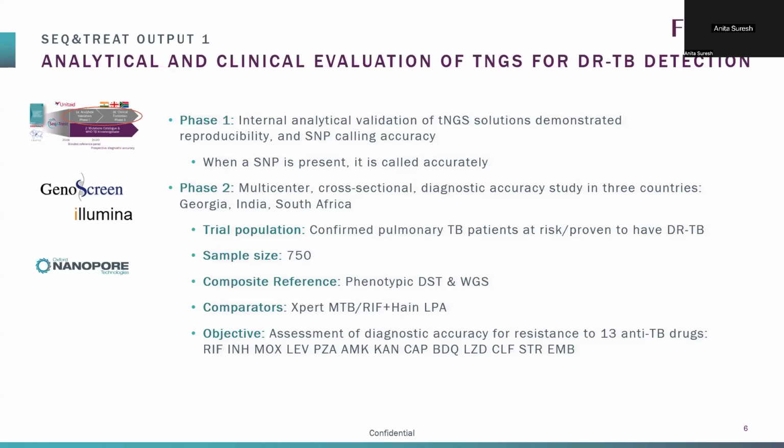As I said, it's a standard of care, and whole genome sequencing, because you want to make sure that the results you're getting in sequencing are also picked up by the targeted sequencing. So for certain drugs, it makes sense to have both. For certain drugs phenotypic, or for certain drugs the sequence actually overrides the phenotypic. So the idea was, as long as it's resistant based on one of 2 methods, we call it resistant.